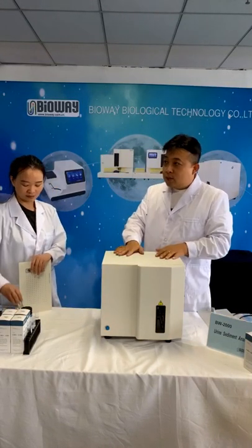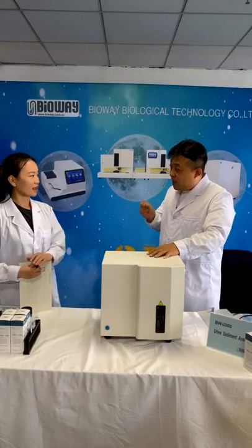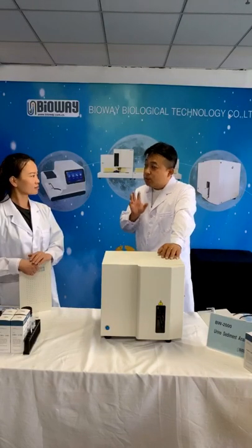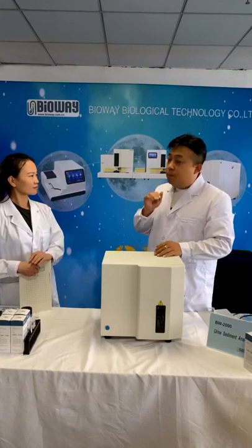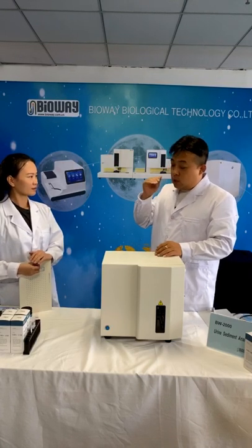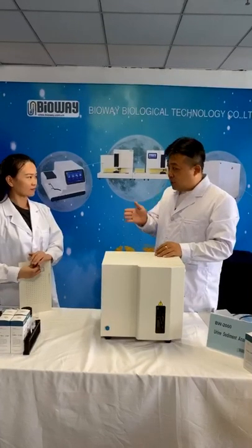The urine sediment analyzer still needs quality control, and we have the positive quality control and also negative. Yeah, the negative quality control shows there's nothing inside, so your result must be zero. But for blood RBC and WBC, you should have the related quality control to prove these items are good for the result.